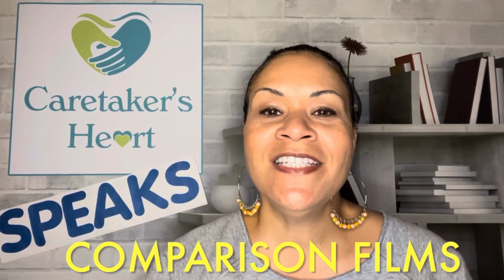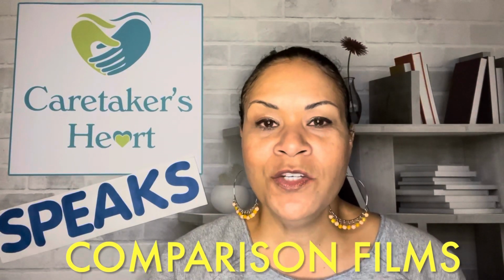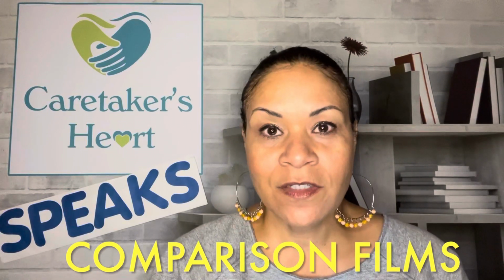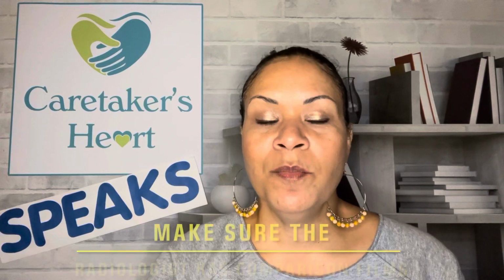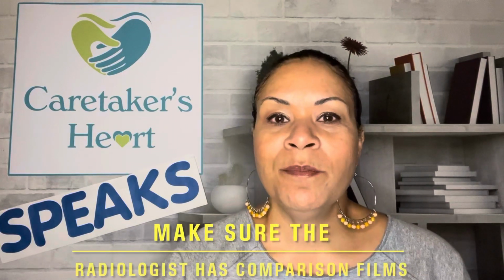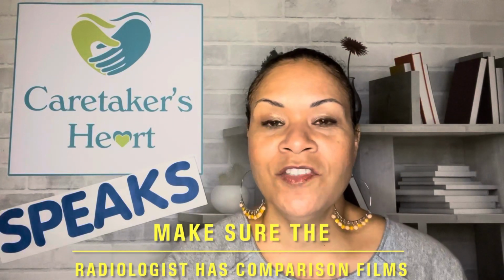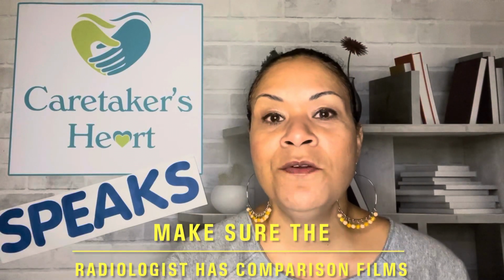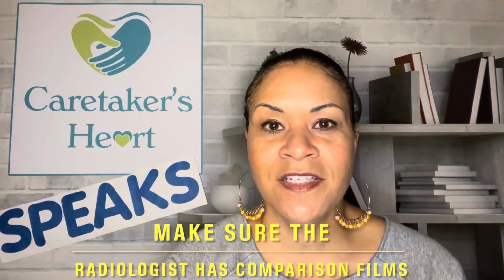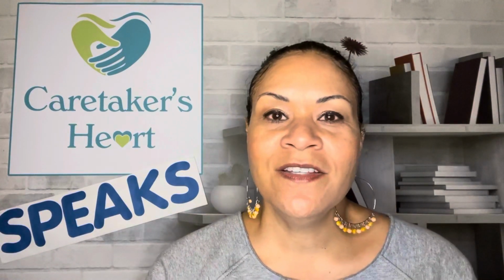Down below that is a section called Comparison, and this details the comparison films that were used to compare this particular mammogram to other mammograms that I had had in the past. It's very important for you to submit comparison films or have comparison films for the radiologist to look at so that they can determine if something in your mammogram is actually a new finding or something that has existed for years.